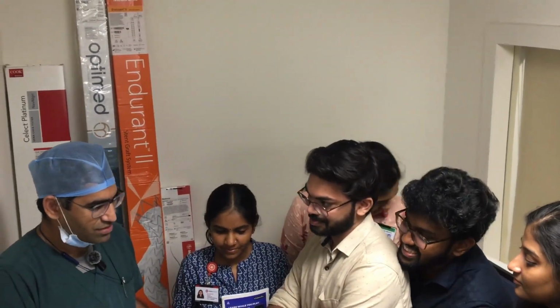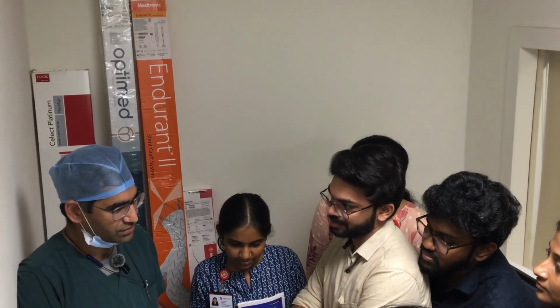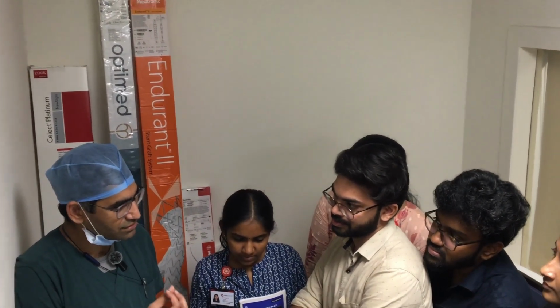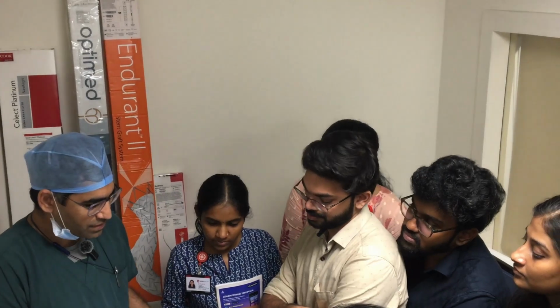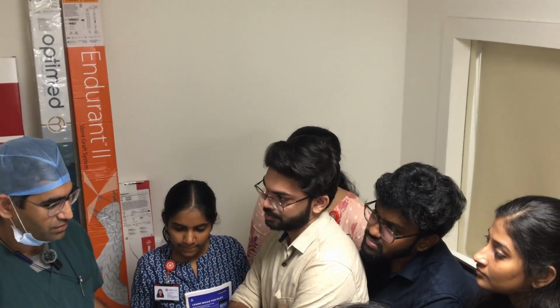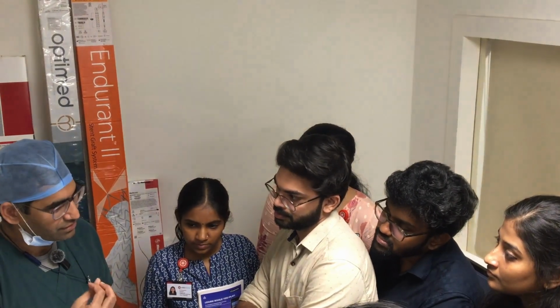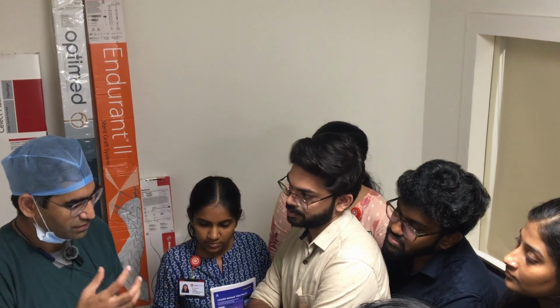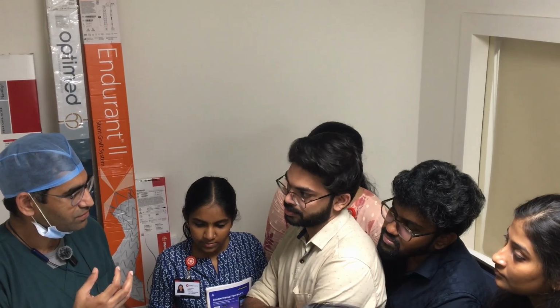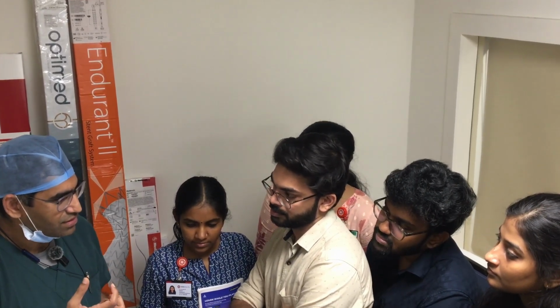A lot of technology and a lot of research goes into how to reach the target site. That's where the microcatheter comes in. So you take a big catheter, inside you take another catheter, inside that another catheter. Sometimes there may be 3 or 4 catheters, one inside another.